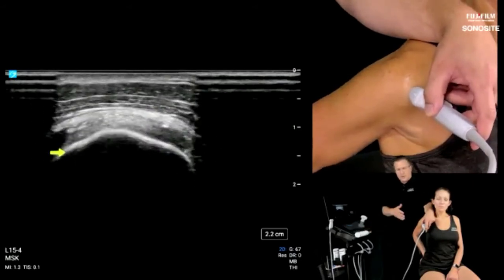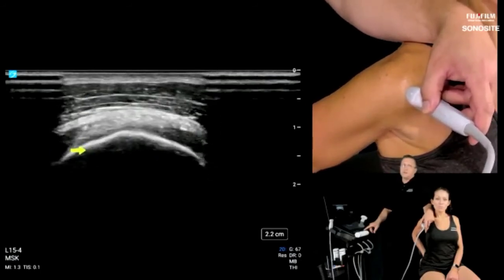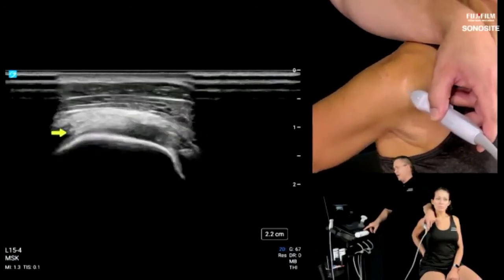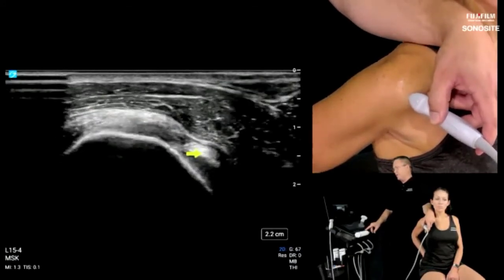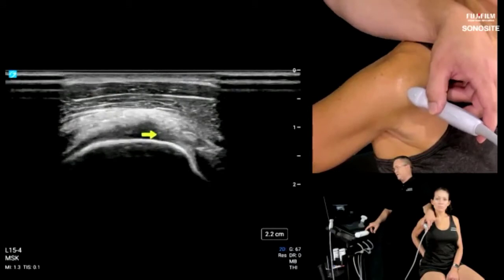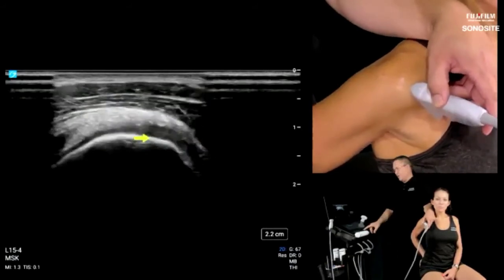So we're looking at the coronal equivalent of an MRI, sagittal, sorry. So this is the sagittal equivalent of the MRI of the footprint of the supraspinatus and infraspinatus. And we know this is supraspinatus here because the neighboring structure is the biceps tendon, and then there are some rotator cuff interval structures here, but we've got supraspinatus in short axis. This is at the enthesis, or the greater tuberosity footprint, and what I'm going to do is just pull the probe proximally until I see humeral head.